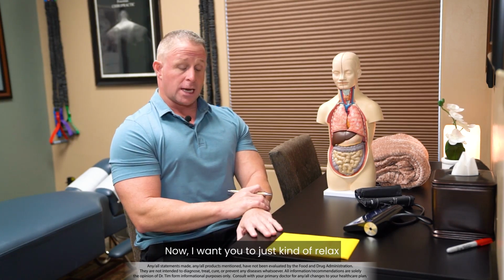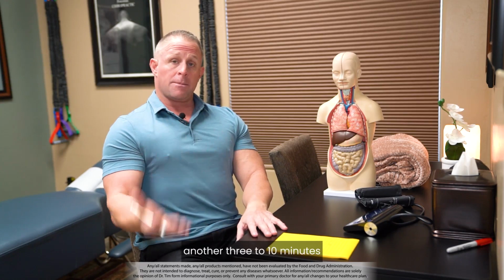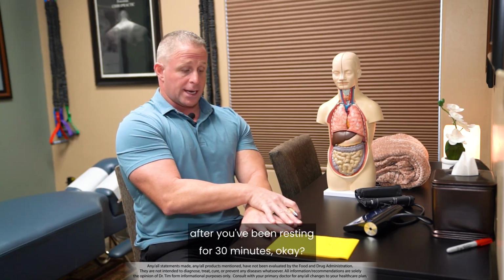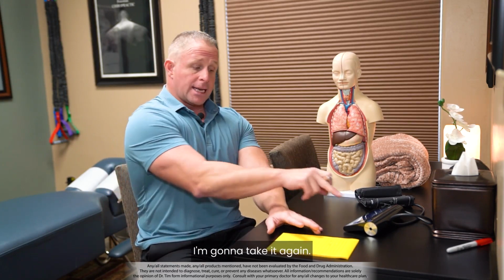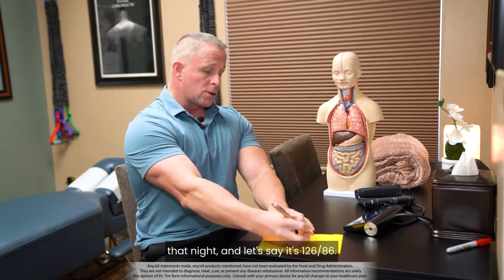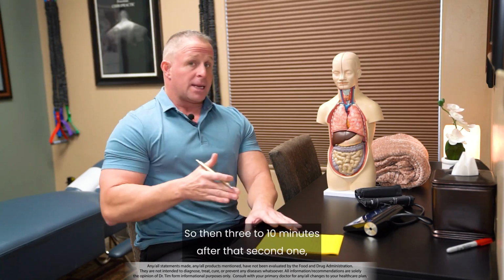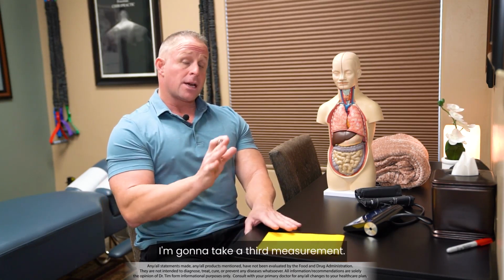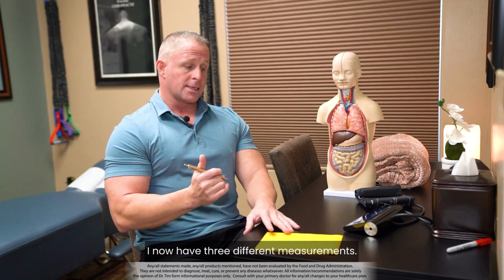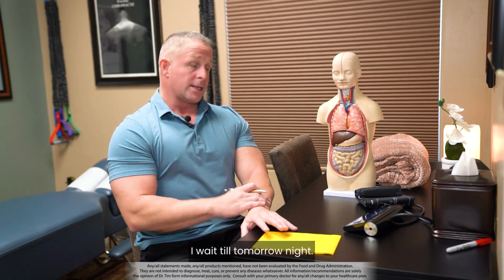Now I want you to just kind of relax another 3 to 10 minutes after that first measurement, after you've been resting for 30 minutes, okay? So after about 3 to 10 minutes, I'm gonna take it again. I'm gonna take a second blood pressure reading that night, and let's say it's 126/86. So then 3 to 10 minutes after that second one, I'm gonna take a third measurement. So Friday evening, I now have 3 different measurements. I'm done, I put all this away, I wait till tomorrow night.